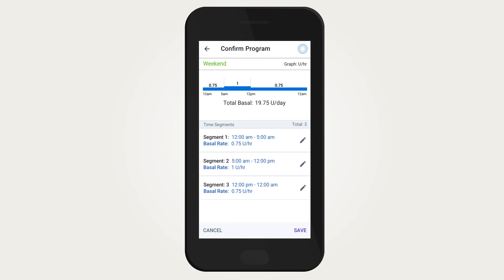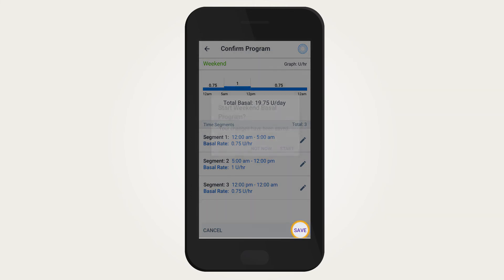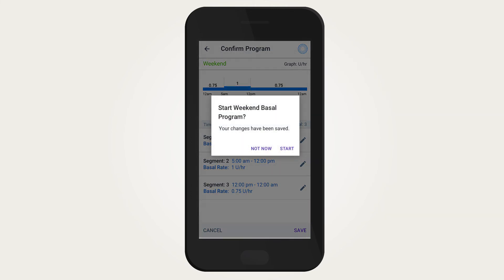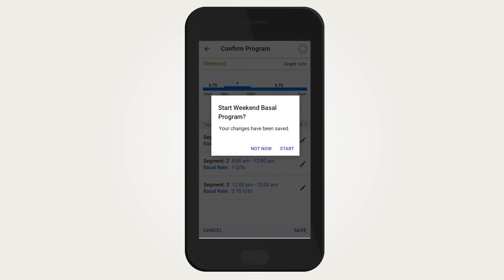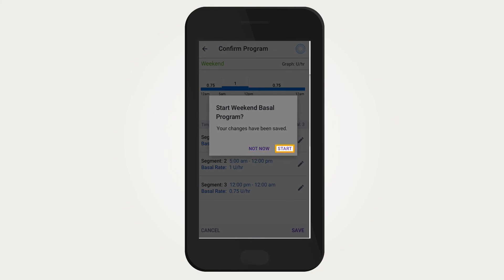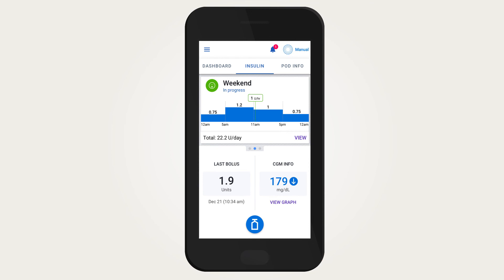Continue repeating these steps until the final segment ends at midnight. Review the basal program and check that the graph and individual segment values are correct. Once everything is confirmed correct, tap Save.